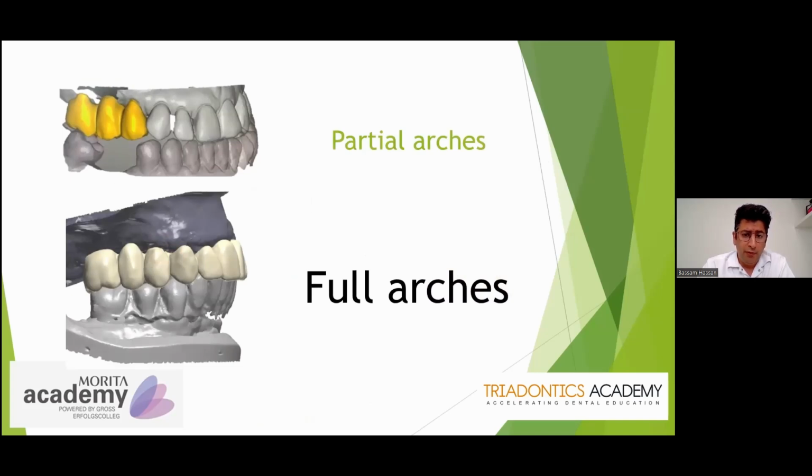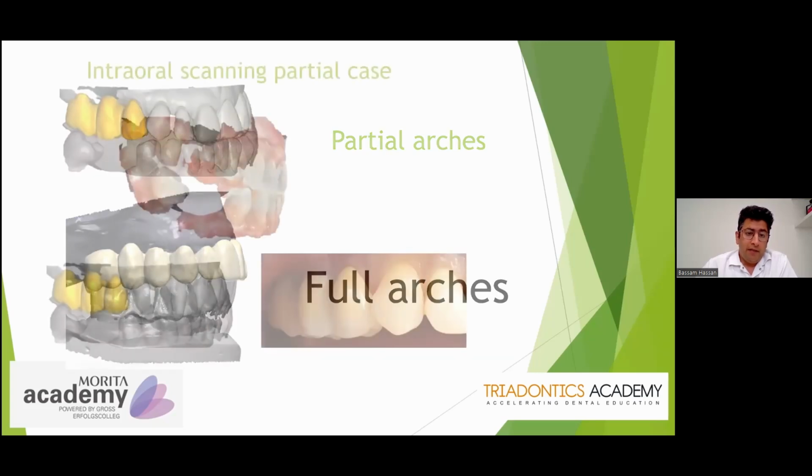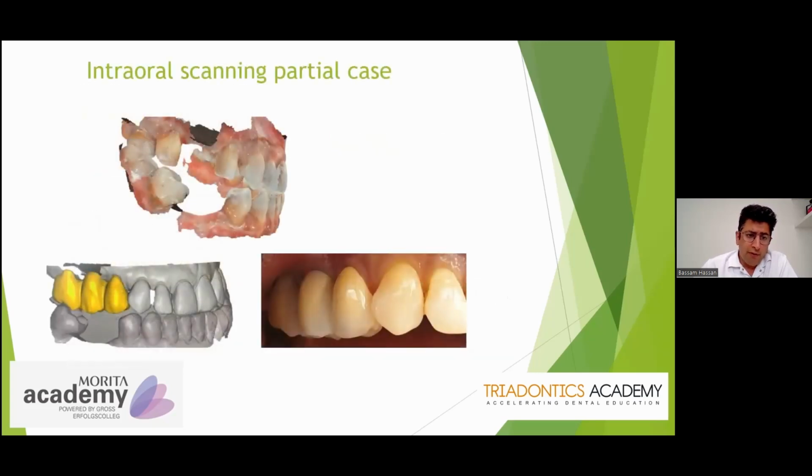make a distinction, very early, whether you're going to stay in partial cases, or you're also going to do full arches as well. If you're sticking to partial arches and partial cases, then life with digital workflow becomes simpler and easier. But you can never know if you are going to step up and start doing full arches within a year or two. So you cannot assume that you only want to do e.max crowns, or only facings, or only 3 unit bridges. Regardless, digital workflow has traditionally worked better for smaller cases than for larger cases in the past.